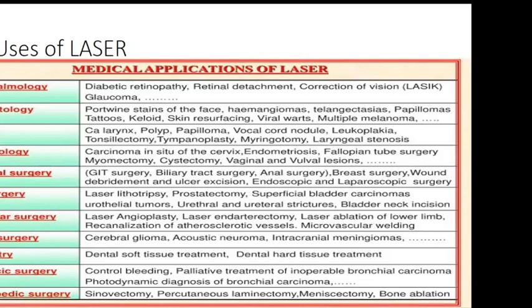It can be used in dermatology. It is used in ENT. In our setting, most of the time, it's used in ENT. It can be used in gynecology, general surgery, urology, vascular, and then neurosurgery, dentistry, thoracic surgery, and also orthopedics.